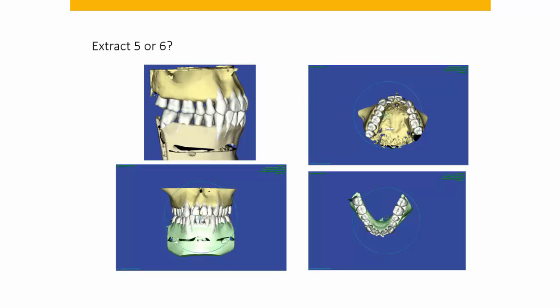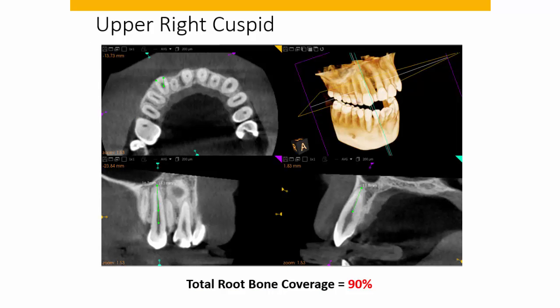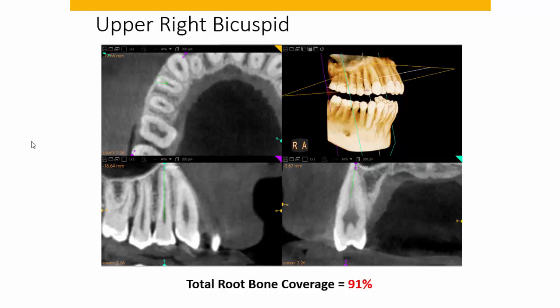If you extract the upper right first bicuspid, you need to distalize the upper cuspid into the class one position. If you extract the upper cuspid, the upper first bicuspid really doesn't need to be moved that much. One thing we look at using cone beam CT is the amount of bone surrounding the root — how much of the circumference is covered with bone, measured from the CEJ to the apex. This gentleman's upper right cuspid has about 90% total root bone coverage, and the upper right first bicuspid has about 91%.